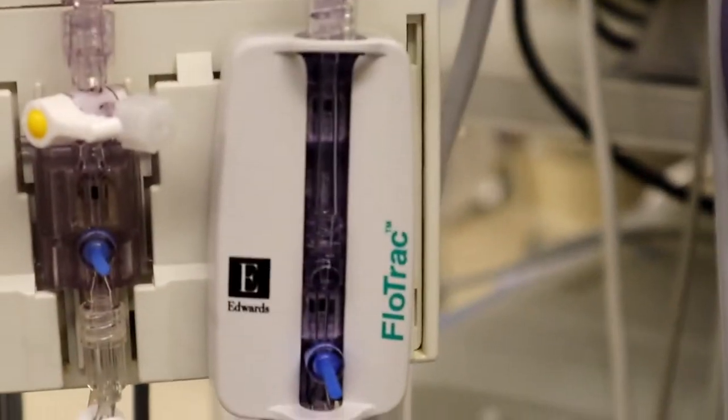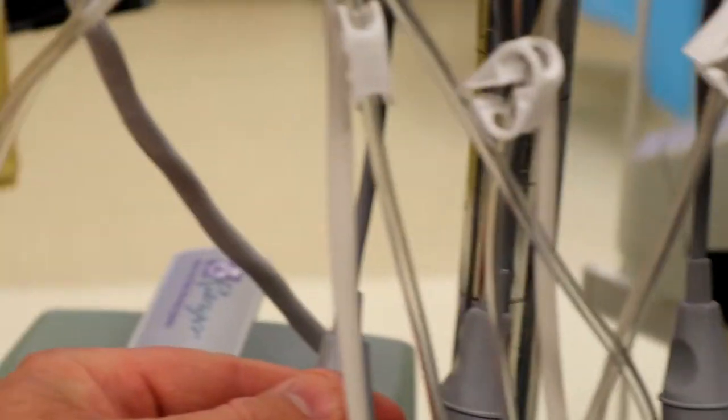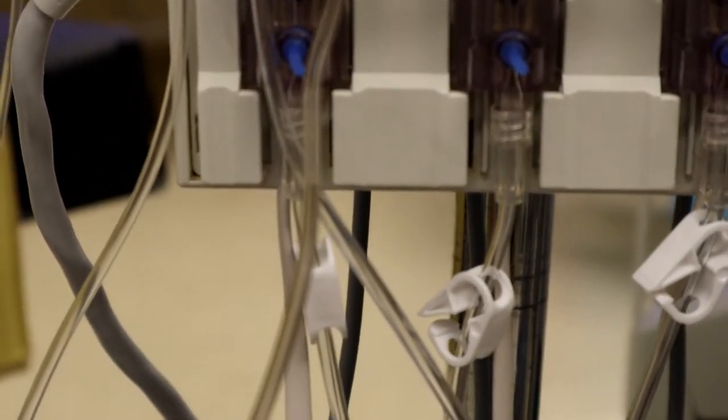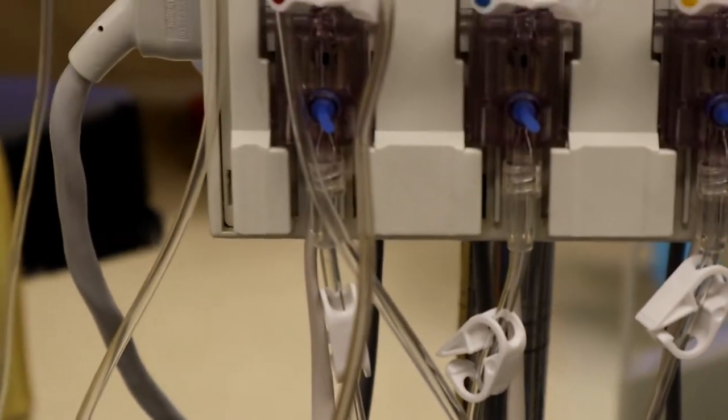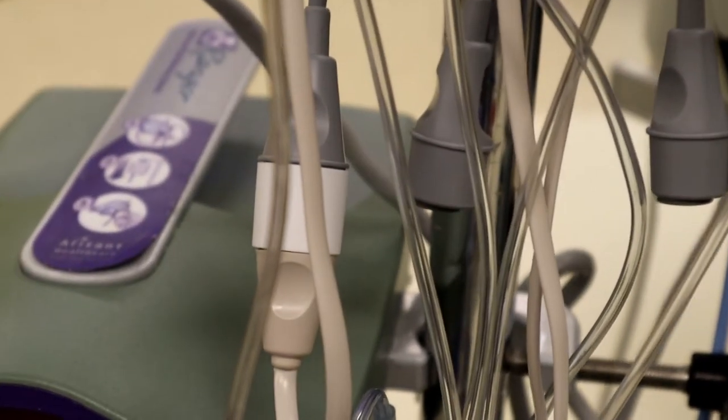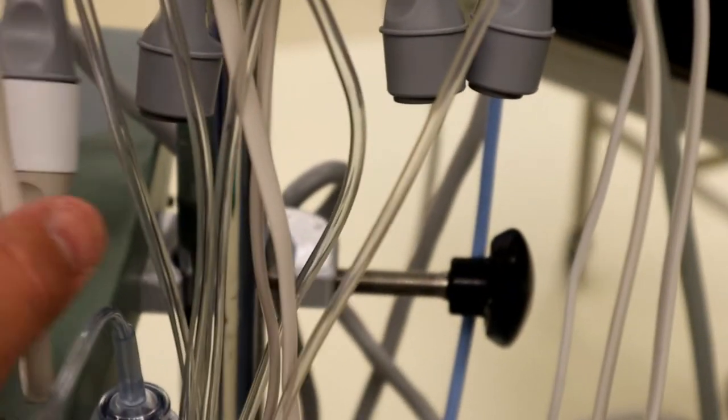You cannot connect the femoral line and the radial at the same time in EPIC because it'll cancel them out and it won't import anything. So what we do is, once we get the patient back here and asleep and they've got their A-line in, we'll connect our regular A-line here.